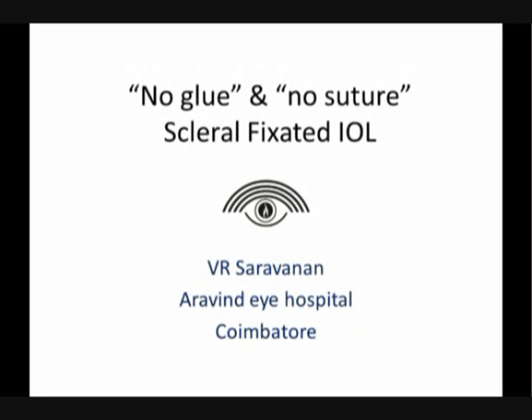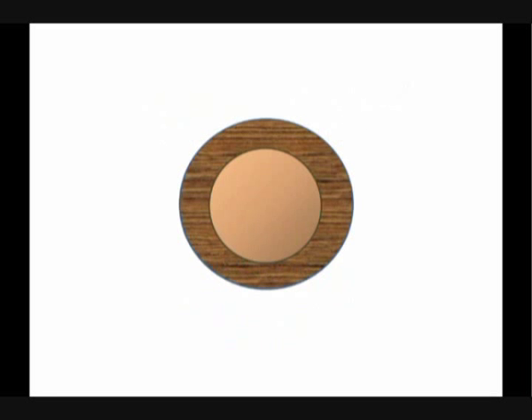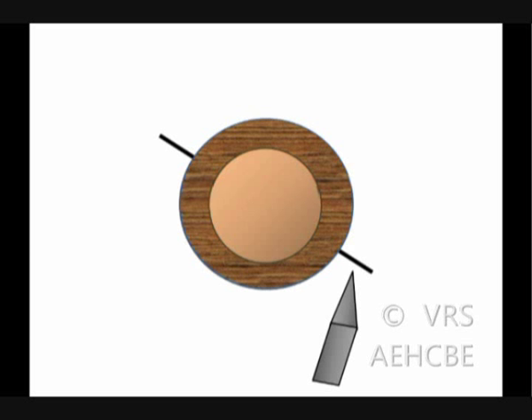No suture, no glue, scleral fixated IOL. On either side of the cornea, two radial cuts are made 180 degrees apart involving approximately 50% of the scleral thickness. Using a 1 mm to 1.5 mm keratome blade, scleral tunnels are made parallel to the limbus on either side from the radial cut which was made earlier.